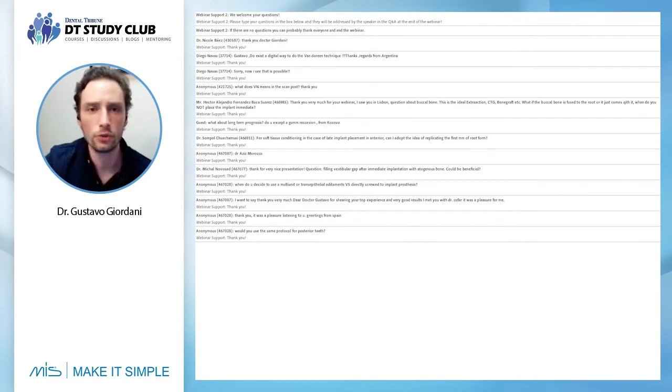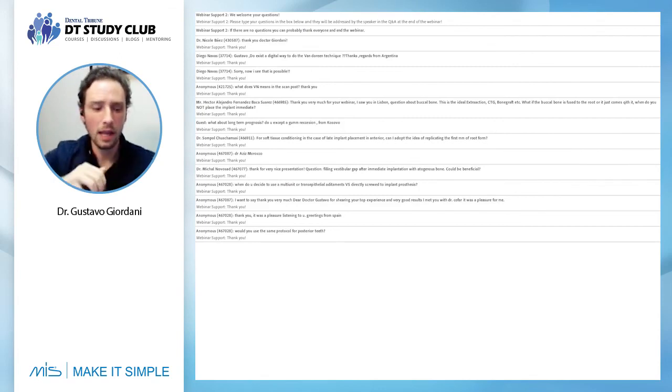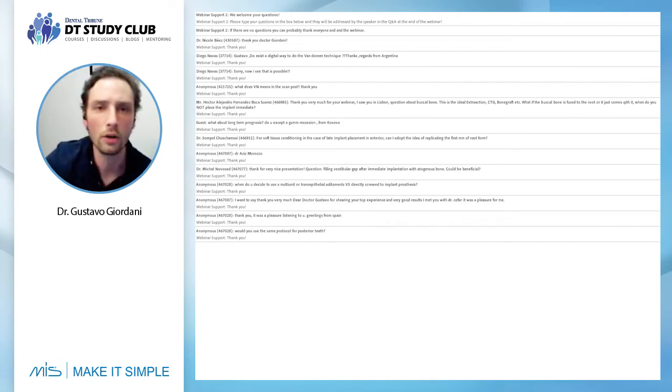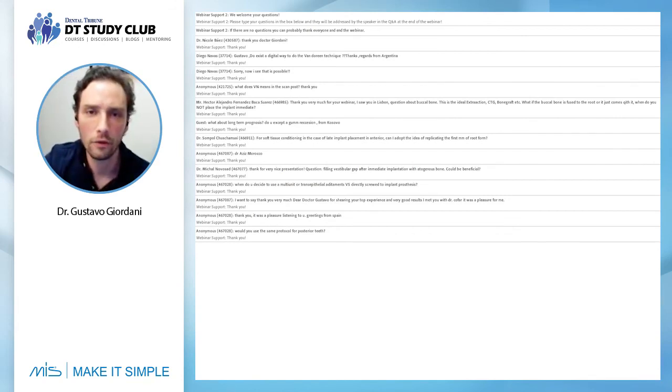But what the literature shows and what we have in our experience, when you use a connective tissue graft, when you have more than 2 millimeters, when you have the biomaterial there, when you have the implant in the correct position, and you have a good emergence profile to support everything, and you don't push the tissue in the horizontal direction, you don't expect recession. This is pretty safe for our patients. But you need to respect the protocol. If you don't respect it and you lose one or two steps, you can have recessions in the short, medium or long term of your case.